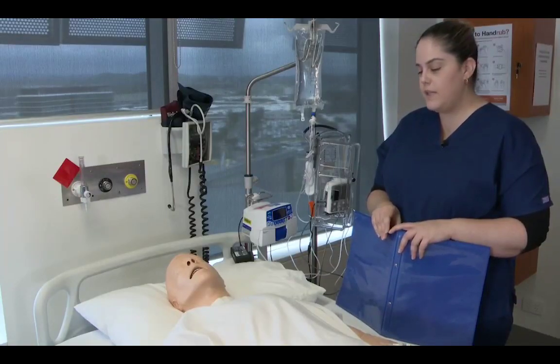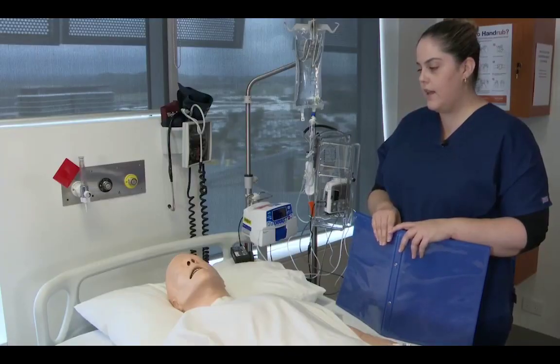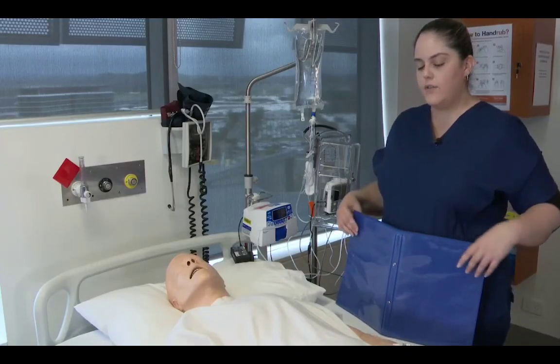Are you happy for me to continue to do that procedure? Are you happy for me to attach that and start that? You are? Okay, thank you so much.